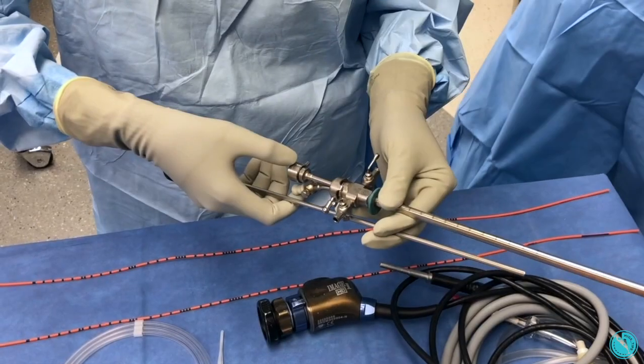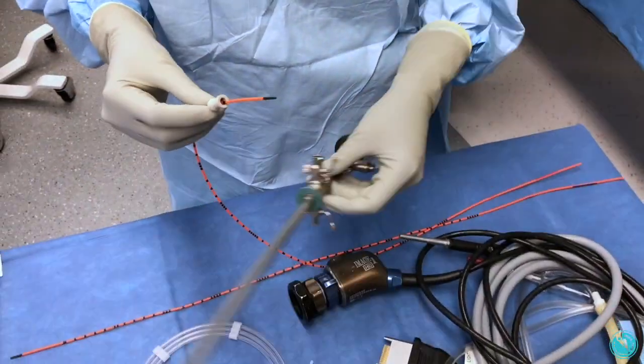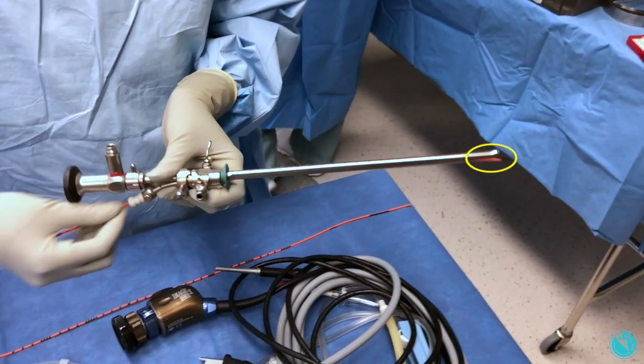Slide the 30 degree lens into the 22 French sheath and lock together. Slide the catheter into the rubber nipple approximately 4 cm, and place the nipple on the opening catheter port. Advance and retract the catheter until just shielded by the sheath.